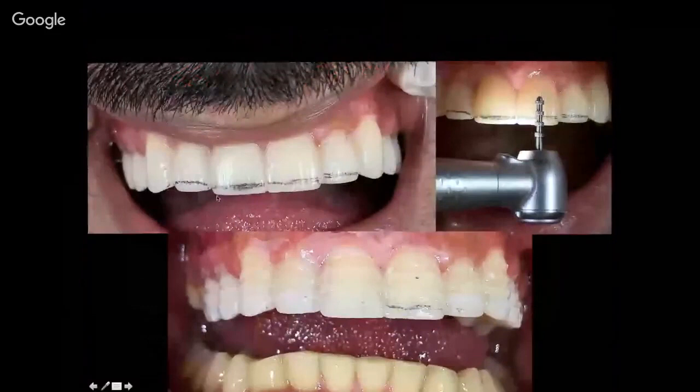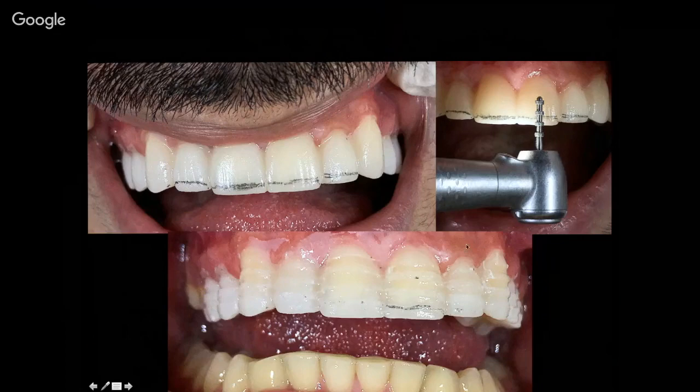Coming back to our case, we have to shorten the incisal edge 1 to 1.2 millimeters, and then make 3 other grooves above this line, 0.4 millimeters deep, with the gauging bur on all the teeth.